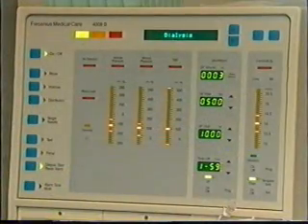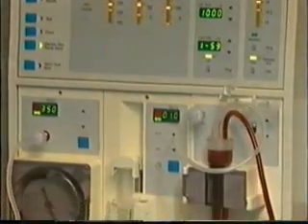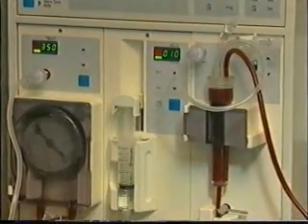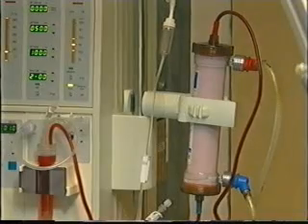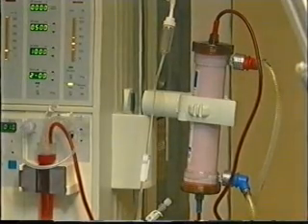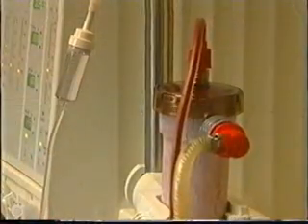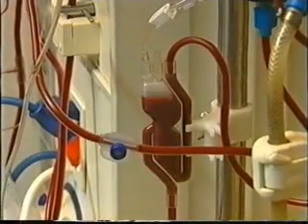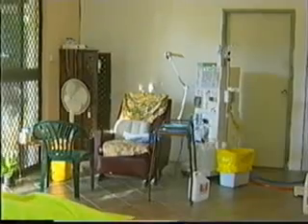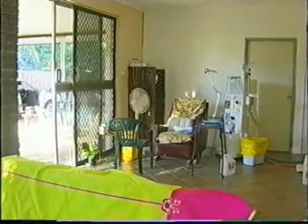There are many different sorts of kidney machines. They all try to take rubbish from the blood that collects in your body when your kidneys don't work. This rubbish in your blood can eventually poison you. Cleaning your blood with a machine is called dialysis. Yapa from our communities are on machines called hemodialysis machines. Hemo is an old-time word for blood. So this kidney machine takes and cleans blood, then puts it back safely into the person.